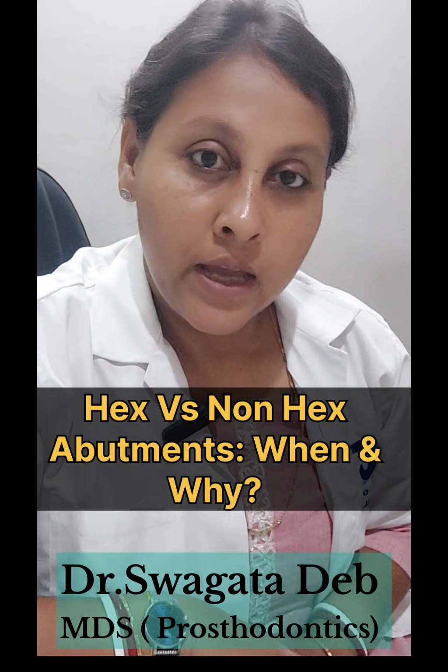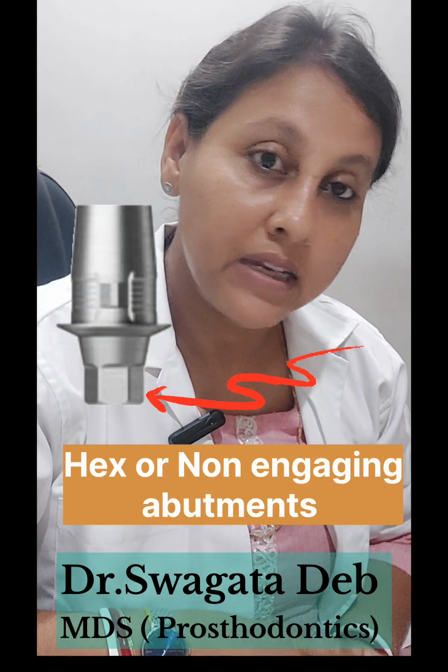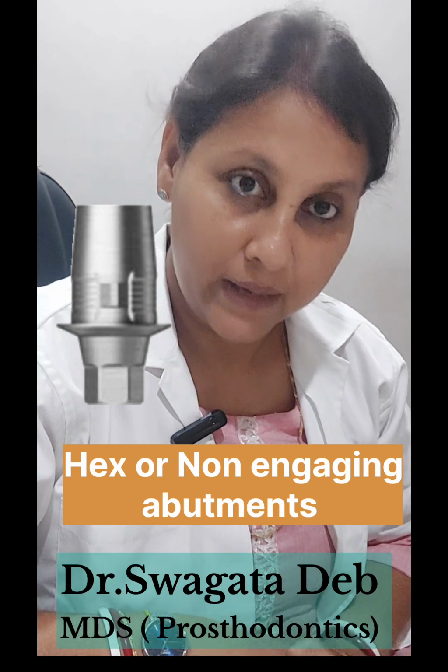Hello everyone. Today's video is about implant abutments, and not just any abutments. It is specifically about hexed and non-hexed abutments. A hex abutment has surfaces matching the inner hex of the implants.